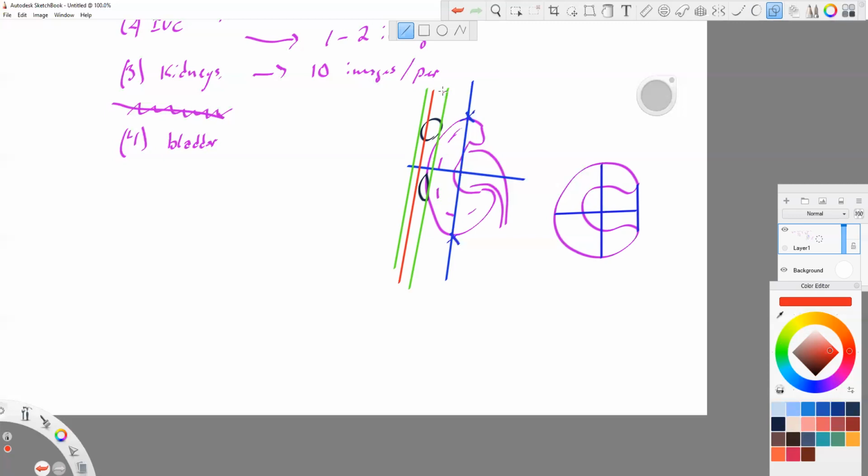And so maybe I'll do that. I'll come in, image, and then I'm going to continue to image through the kidney. The red lines are the actual pictures I am taking. I have a couple of extras because there was a cyst out here, but if I didn't have that cyst, I would have 1, 2, 3, 4, 5 images perhaps. And then I'll be done with my sagittal.